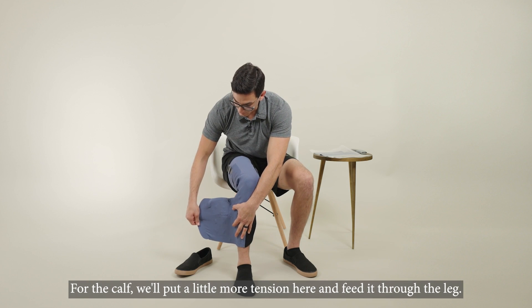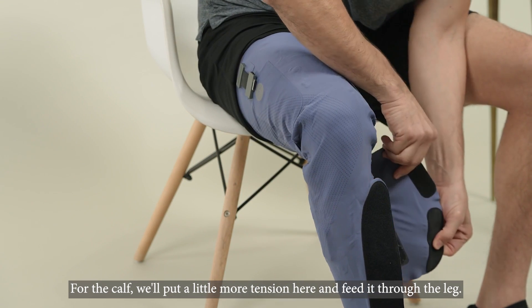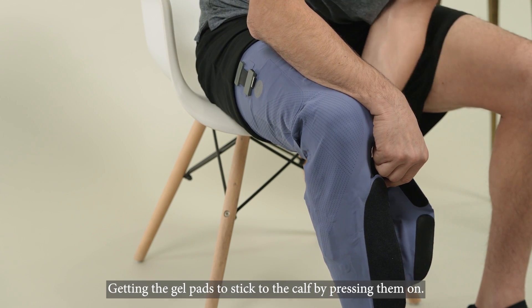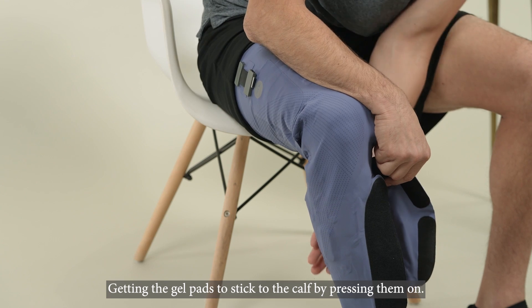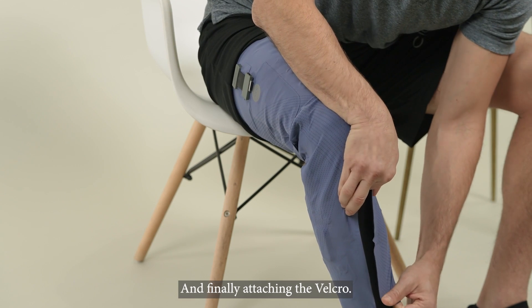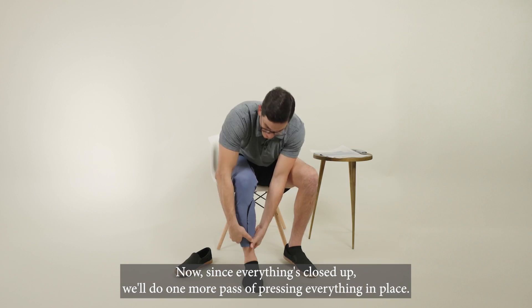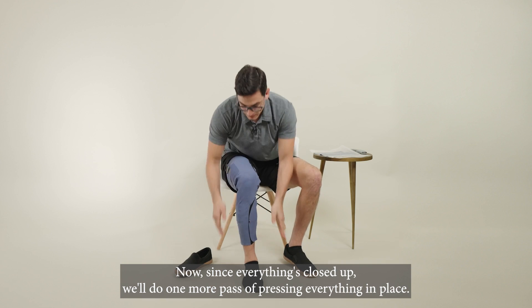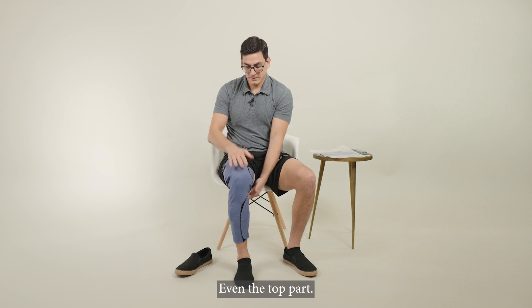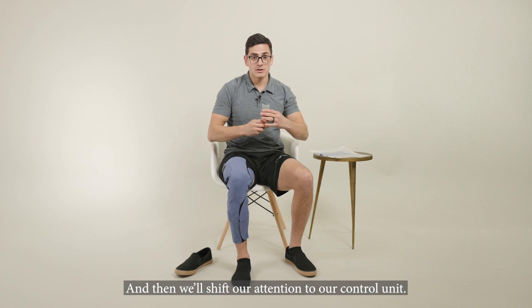For the calf, we'll put a little more tension here and feed it through the leg, creating contact for the gel pads to stick to the calf by pressing them on, and finally attaching the velcro. Now, since everything's closed up, we'll do one more pass of pressing everything in place, even the top part, and then we'll shift our attention to our control unit.